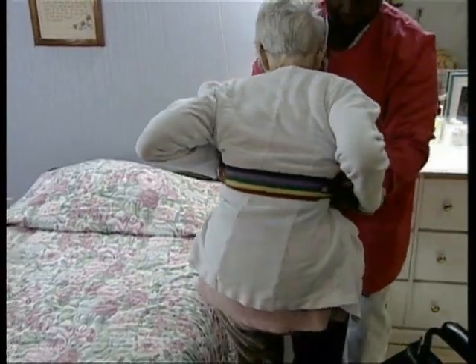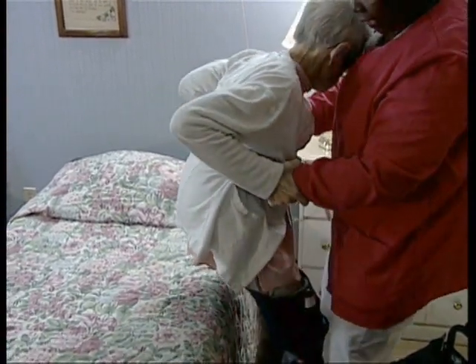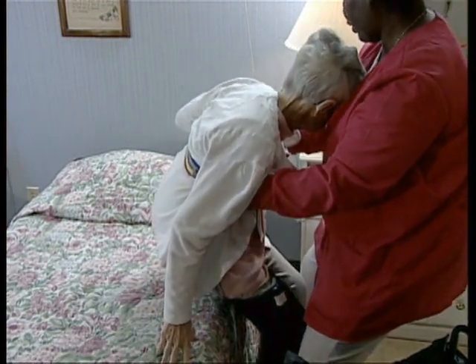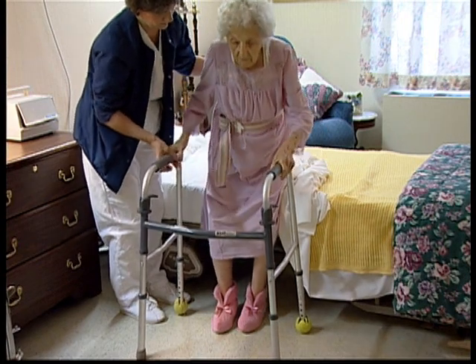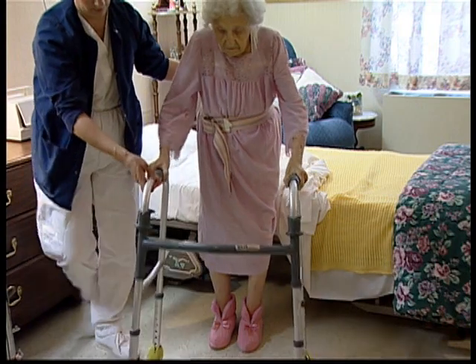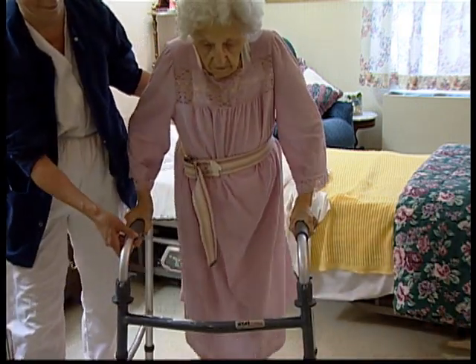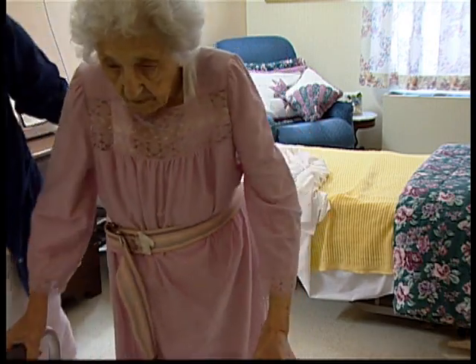Because a gait belt is fastened around a resident's waist, it provides a handle for the caregiver to grasp. This allows for better support and helps you to move a resident with greater ease and safety. Another important advantage is that if there is a loss of balance or the resident begins to fall, you can use the gait belt to ease him or her to the floor if necessary. In this way, a gait belt may help you to prevent falls or injuries.